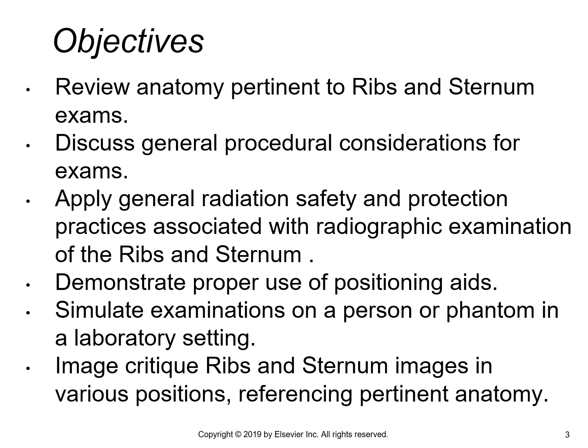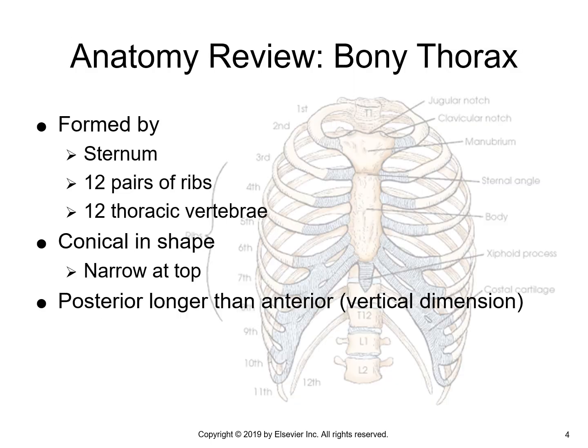And we're going to start injecting a little bit of science. There is the blurred edge penumbra relation to OID that creeps into this lecture, so be watching for that. That's coming up on one of these slides. I have that in there because so often ribs are hairline fractures, and you can literally blur them out if you don't know what you're doing.